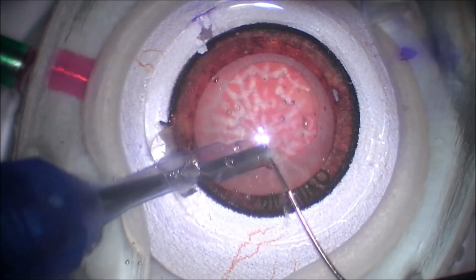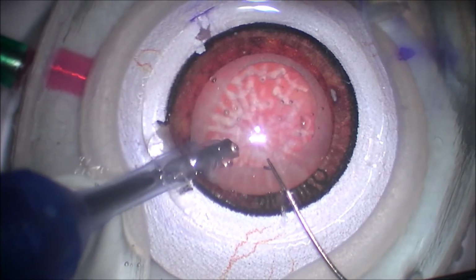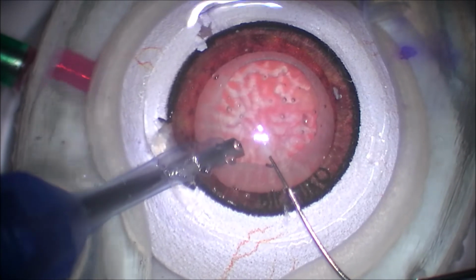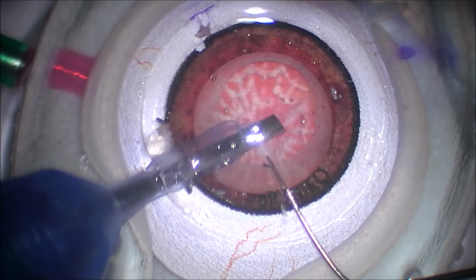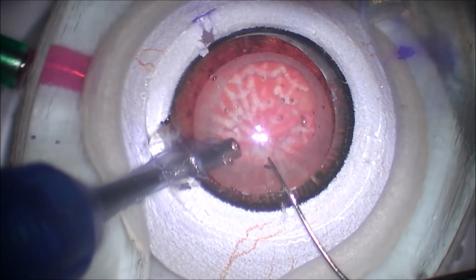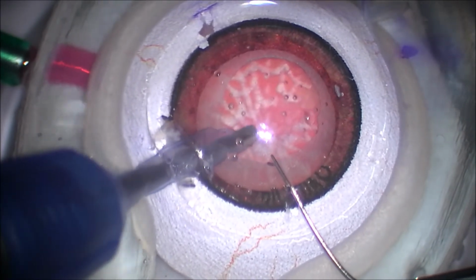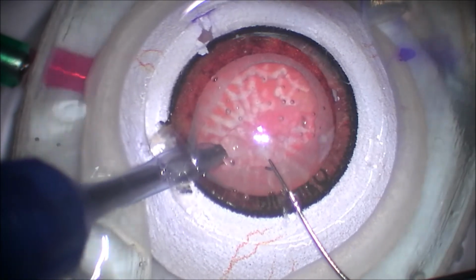I think that's very important for surgeons to know how to pivot the instruments within the incision rather than trying to move translationally. A lot of people who are learning want to move their instruments translationally, forgetting that they're going to be trapped by the incision. So if you move your instruments translationally, what happens? You're going to move the eye in all different directions, and you'll find yourself moving the eye off the screen when you're doing surgery. That's a telltale sign that you're having translational movement within the incision, because you're pushing on the incision and the eye is moving off screen.